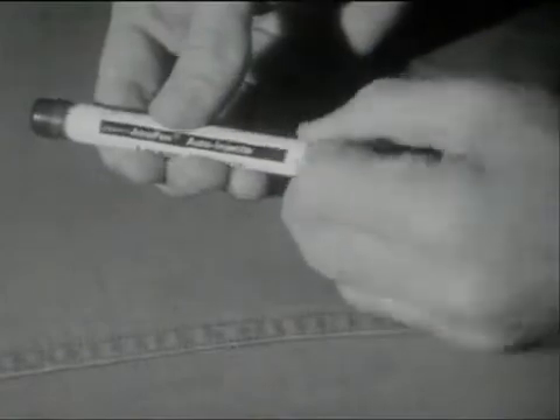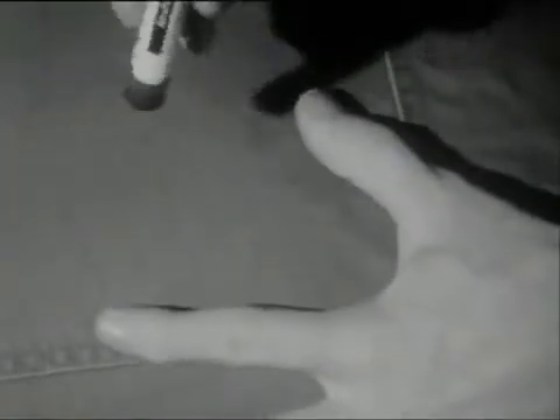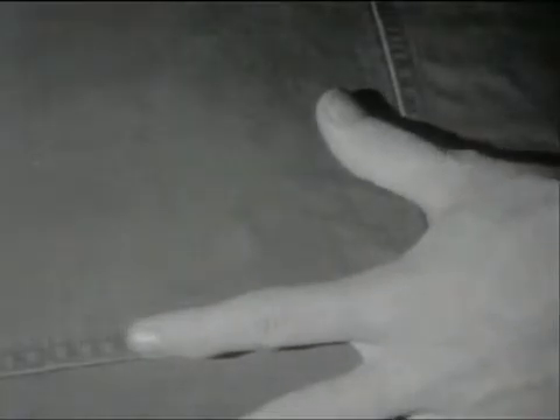You remove the wrapper. Pull off the red safety cap. Press the blue end of the tube hard against the muscle until the needle releases the fluid into the body. For self-injection, the thigh muscles are the easiest to reach.